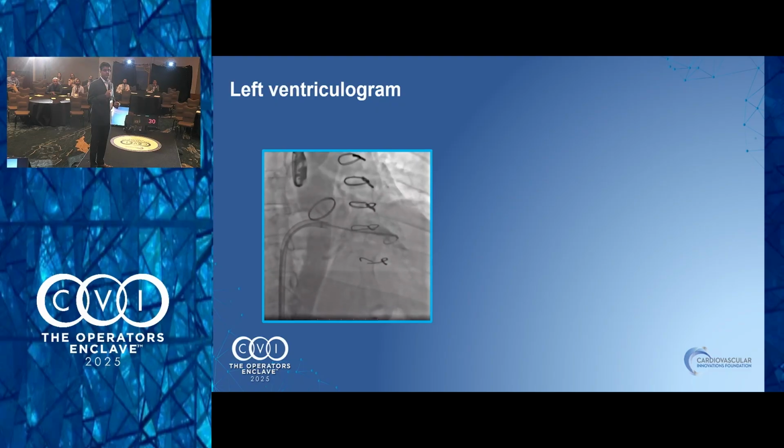Rutgers brought up a good point. An aortogram would have been helpful, honestly. I was not thinking about an aortogram because it's a Bentall. To get the valve out of the Bentall, talking to the surgeon, would be almost impossible, unless it was a bad thing. So we were thinking it has to be something at the suture line.